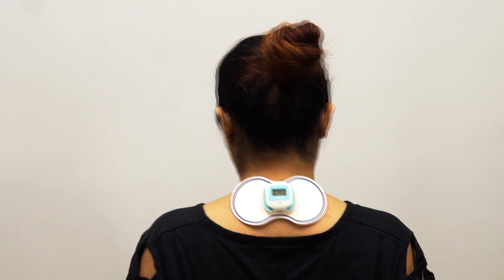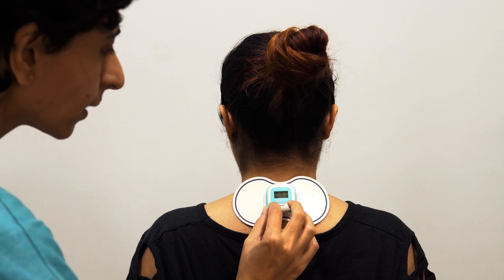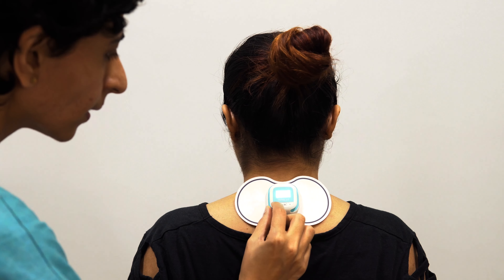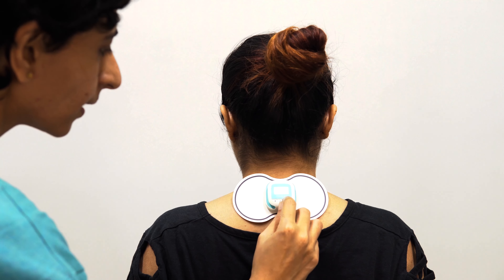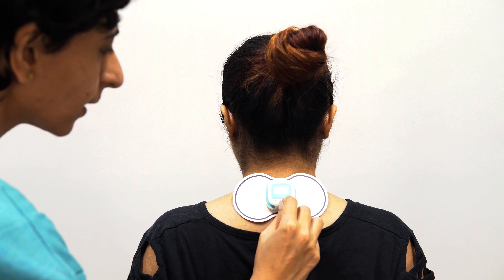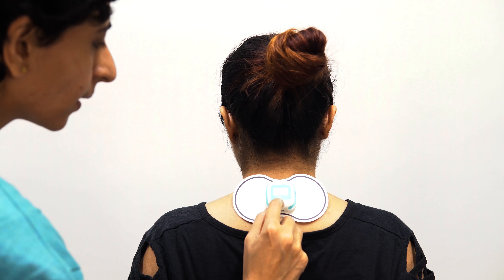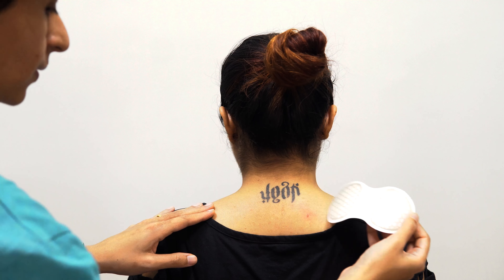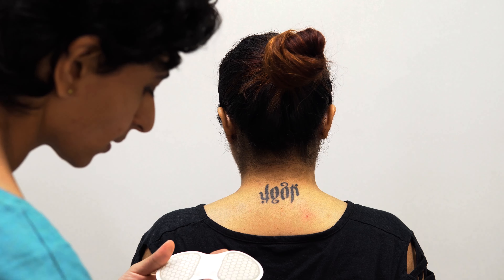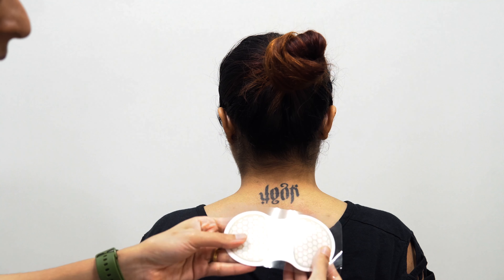Once therapy is done, all you need to do is reduce the intensity, switch off the device, and then remove the electrode pad or patch from the skin. Place it back on the protector film and the product is ready for the next use.